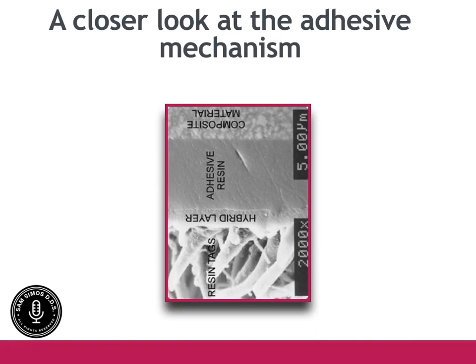So now that we understand the smear layer, I want to take a closer look at the actual adhesive mechanism. What are we doing when we put that material onto the dentin and the enamel? Here's what's happening. You can see inside this pink box, on the bottom, we have the dentin or the collagen tubules. On top of that, we have what we're trying to create, the hybrid layer. Then we have the rest of the adhesive resin on top, and on top of that, we'll put the composite. This is how we get our adhesion, right here in the hybrid layer, right?